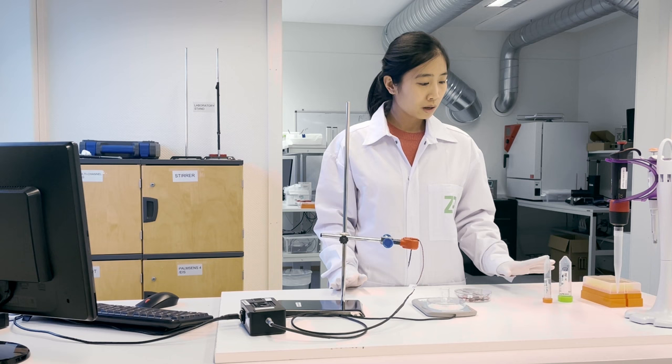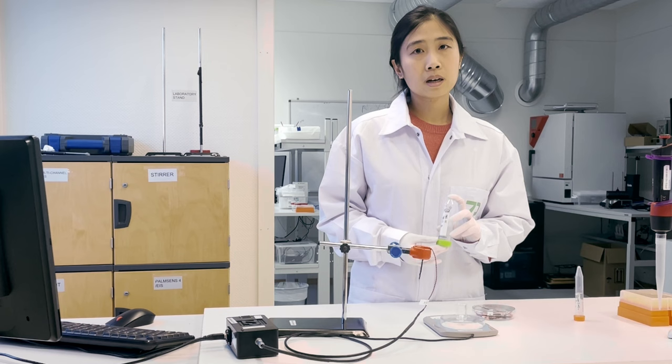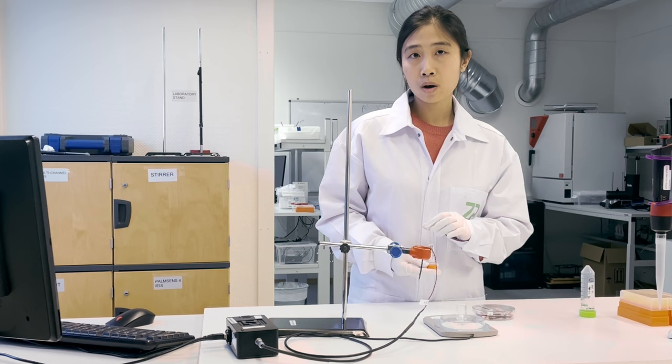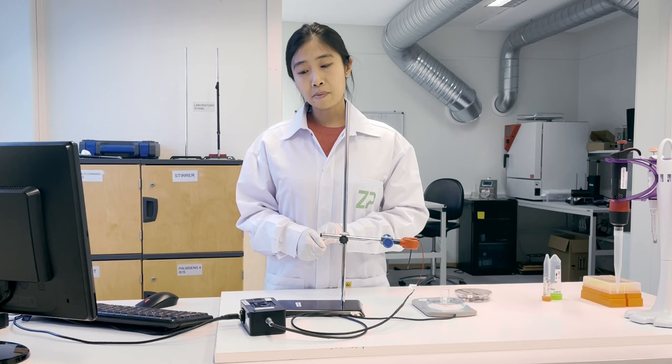Before we start our work, we need to make sure all our setups are ready and all our solutions are well prepared. First of all, we need to have our PBS that doesn't contain any glucose as our blank. And also we need to prepare one molar of glucose solution so that we can spike into this PBS to have a staircase performance in the chronoamperometry.